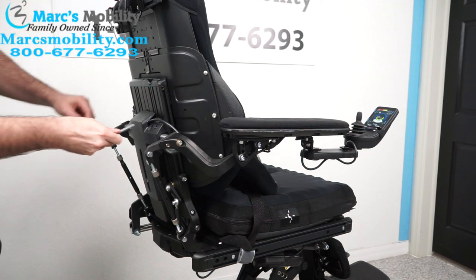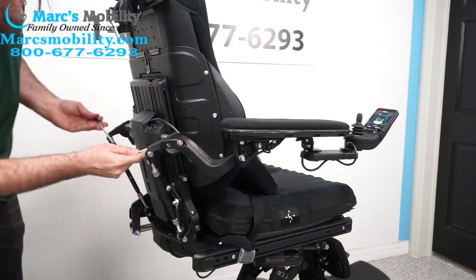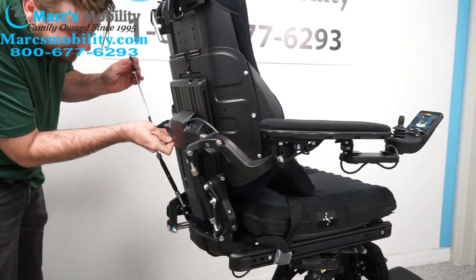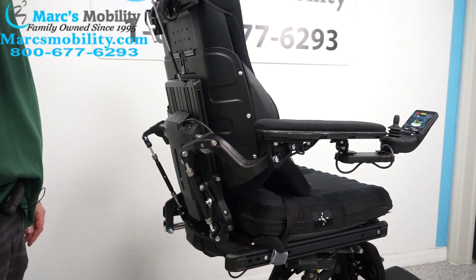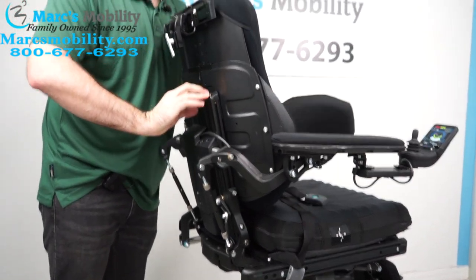Once you're done and have it where you want it to be, tighten these screws back up, put your tool back, pop your headrest back on, and you're ready to go.